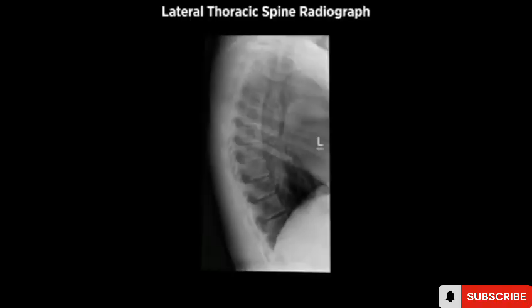A diagnostic AP lateral thoracic spine radiograph must be free of motion and rotation. Demonstrated anatomy to include the open intervertebral disc spaces with proper visualization of soft tissue and bony detail. T1 to T3 are typically not clearly visualized due to superimposed anatomy.